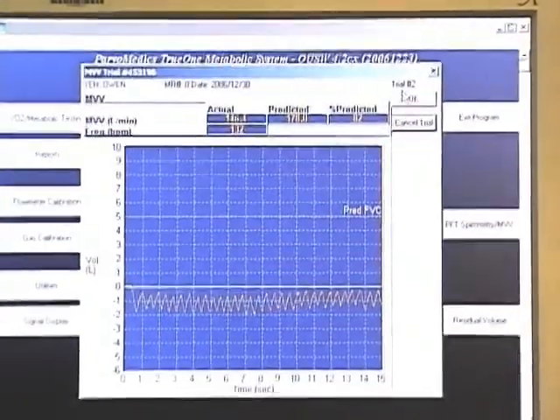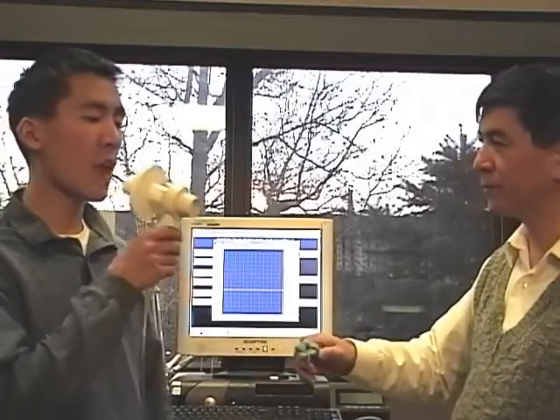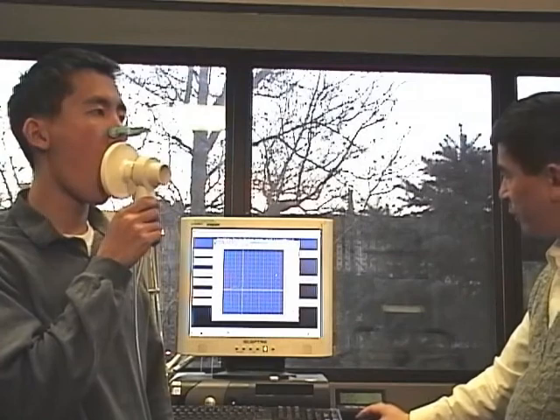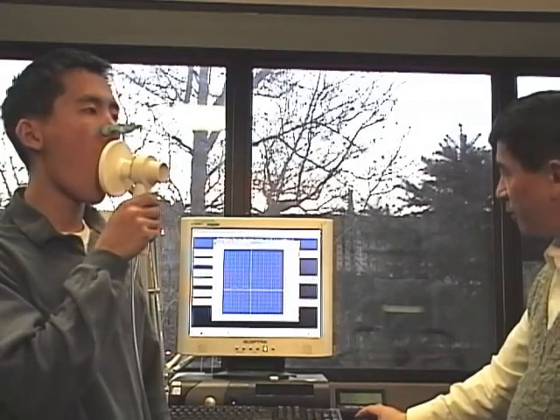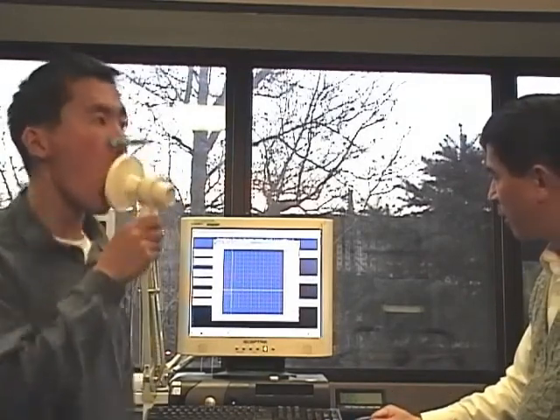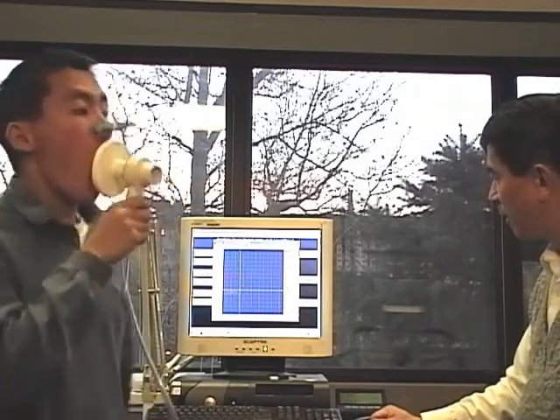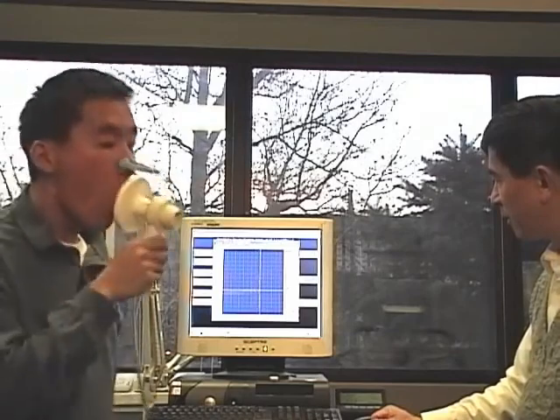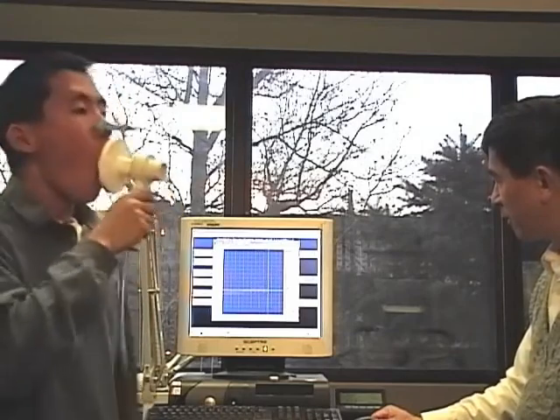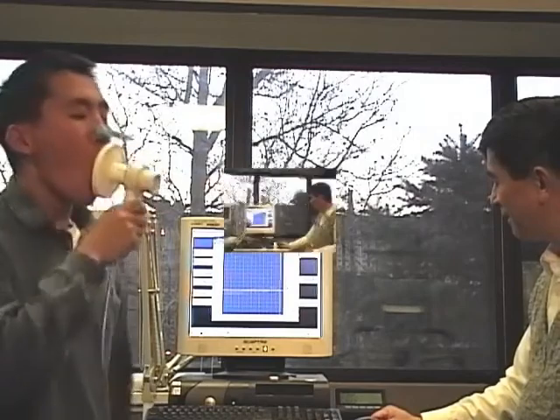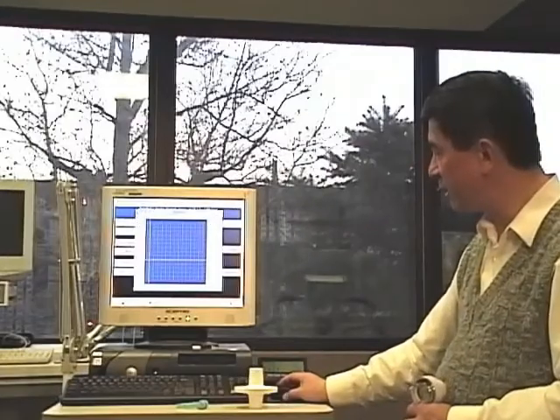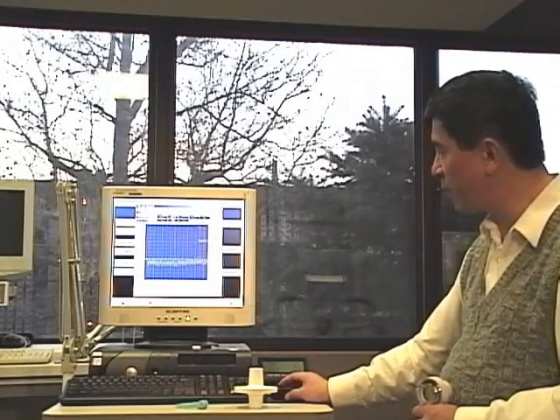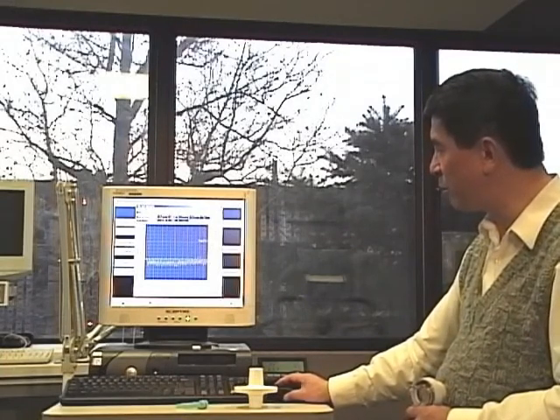The third trial — again in the preview, as soon as we see the signal we say start. And then we click OK. The third button is the end test — we click end test. So we have three of them.